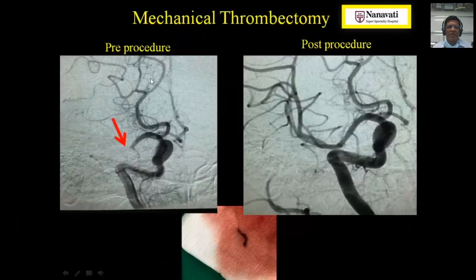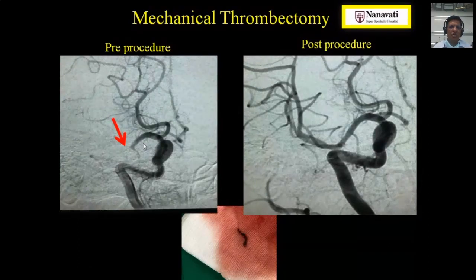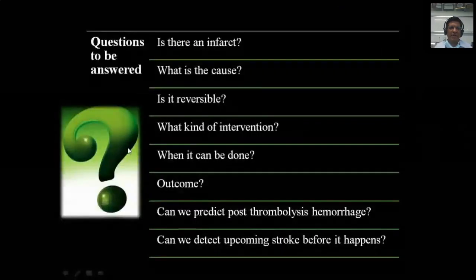Here is one example of mechanical thrombectomy. This patient came with a stroke duration of one and a half hours. We showed hyperacute right MCA stroke on MRI. On DSA, there is a large acute thrombus in the M1 segment of the right MCA. This shows pre-procedure and post-procedure DSA demonstrating complete opening of the entire right MCA, and the thrombus located in the proximal M1 segment.